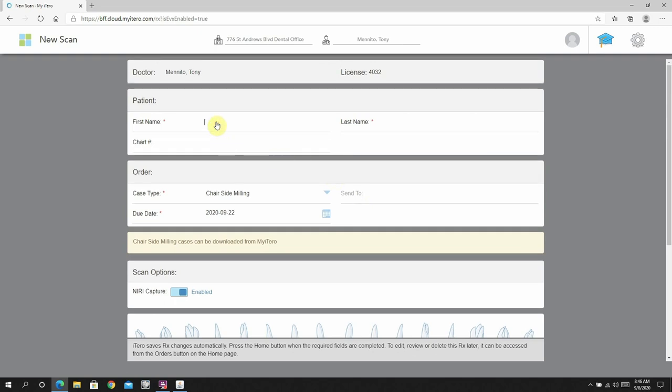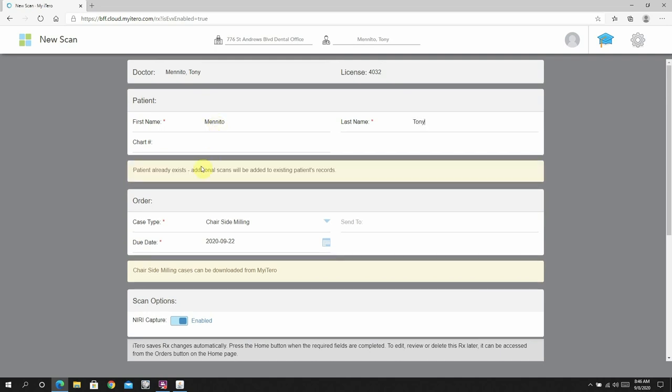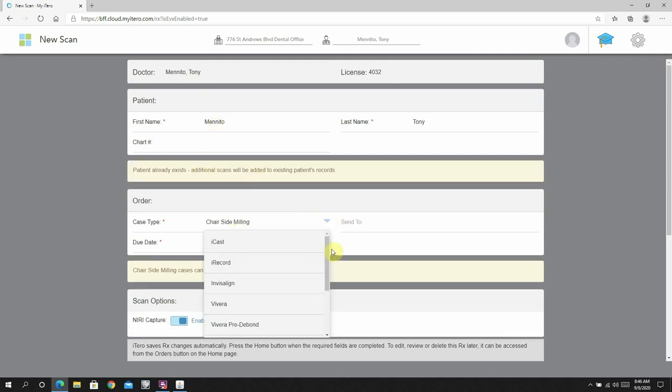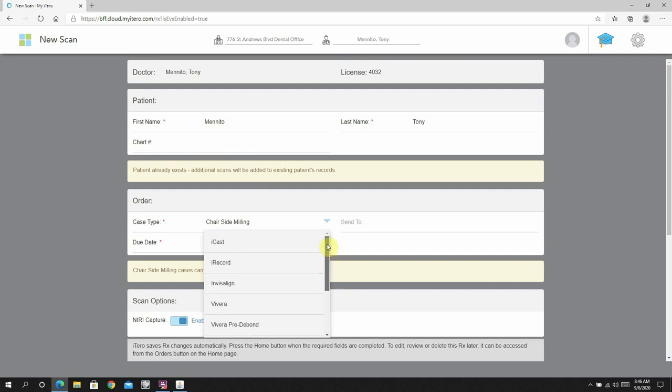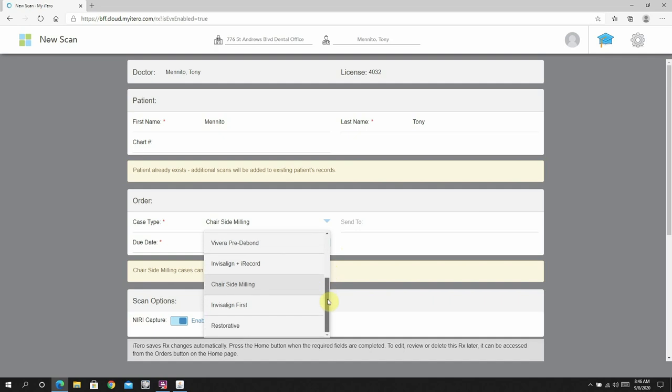This is not something that you will have in all likelihood when you purchase the scanner. You will likely have to call iTero Customer Care to have that added. They will ask you what milling system you are using. Planmecca is not one of the options. E4D is the correct answer to that question.